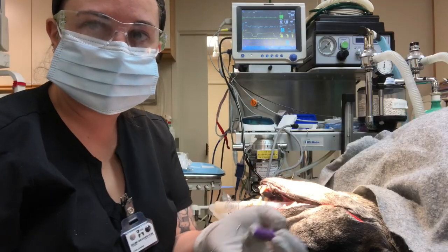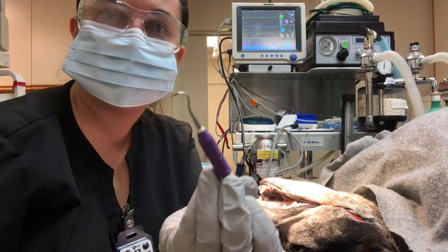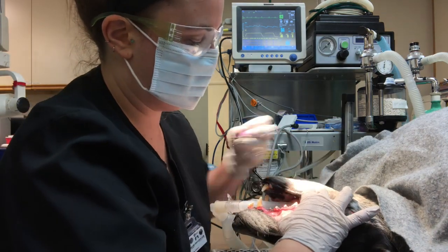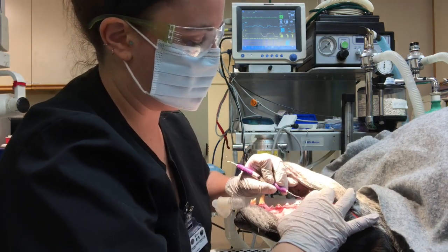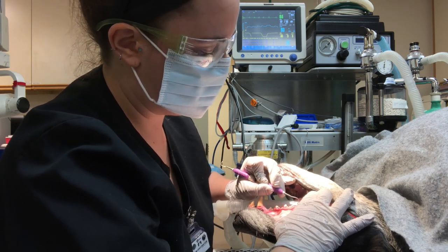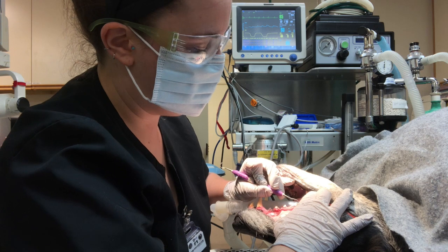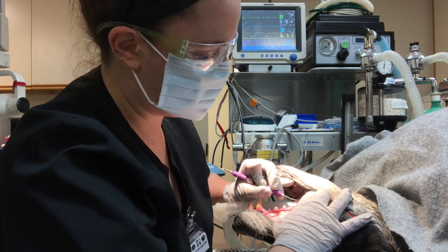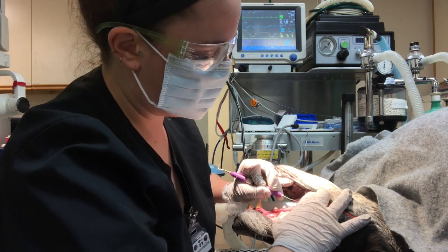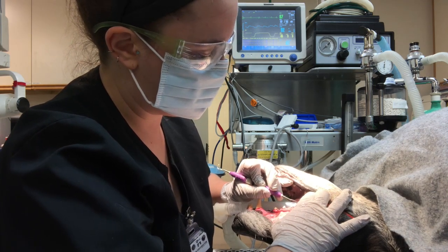For some of those tight spaces on the coronal aspect of the tooth, we want to take our hand scaler and we can use the cutting edge to help clean up the calculus in some of those tight spots where the ultrasonic scaler can't really get to. So like in the crevice of our carnassial tooth here.